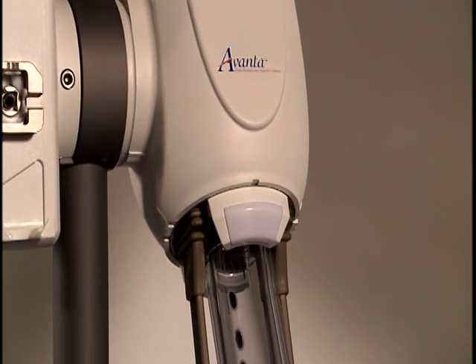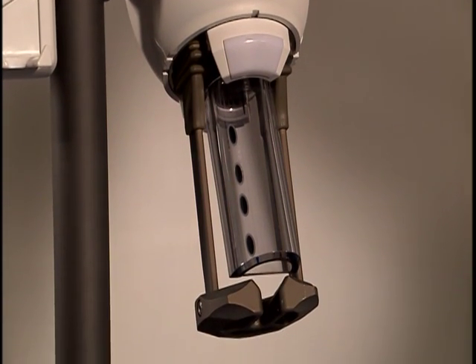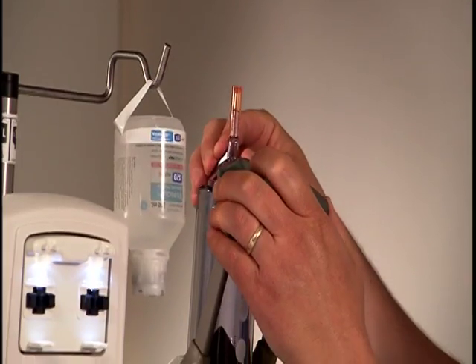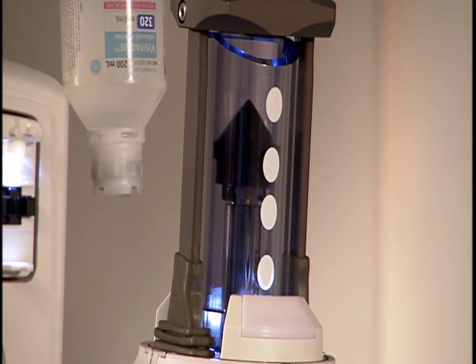The injector head has a pressure jacket that accommodates a 150 milliliter front-load syringe. When the injector is on and a syringe is inserted, the syringe sensor detects the presence of a syringe, supplying supplemental syringe backlighting, which assists with viewing the contents in the syringe.